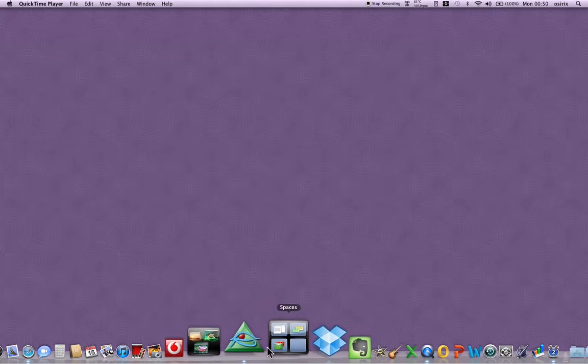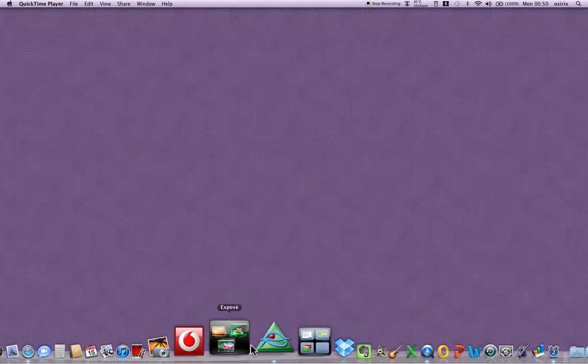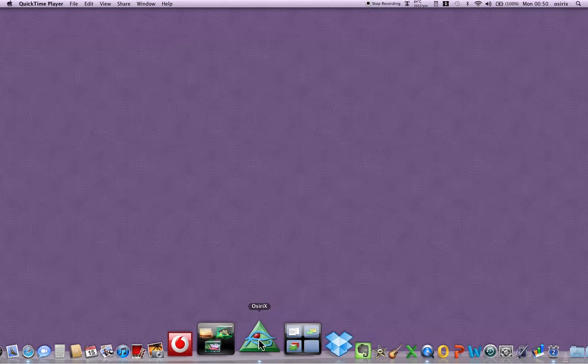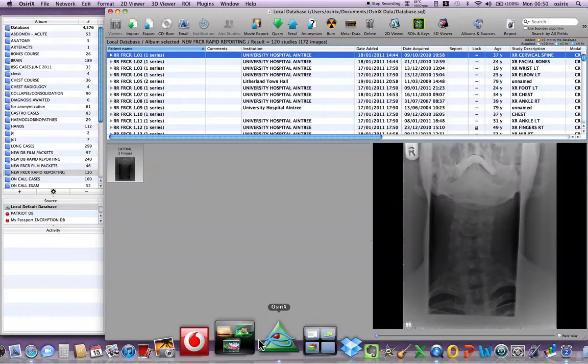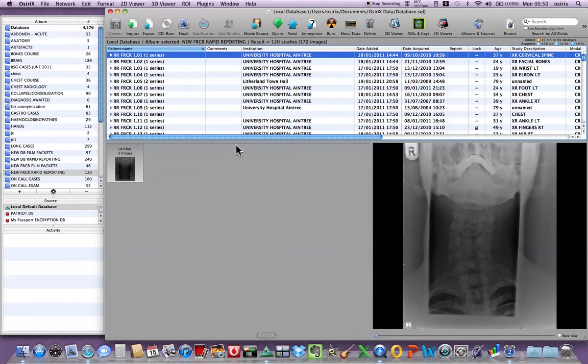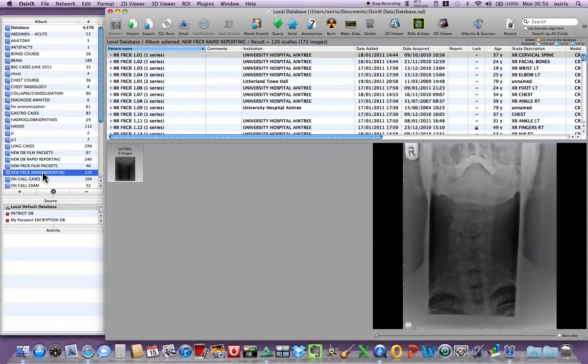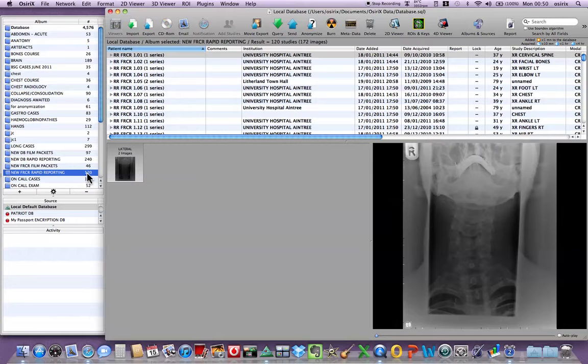It sits on the dock as a green icon. I'm going to press that. This is the database window and what I have done is I've compiled the rapid reporting films in an album which contains 120 cases. So this album has got four packets each containing 30 cases.